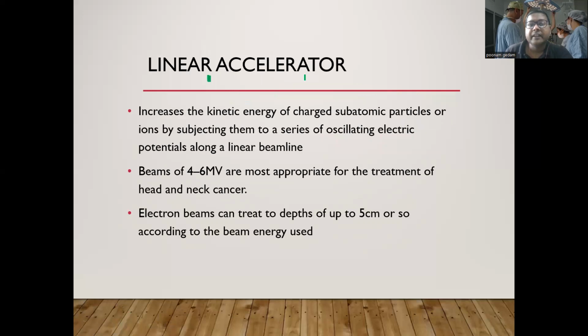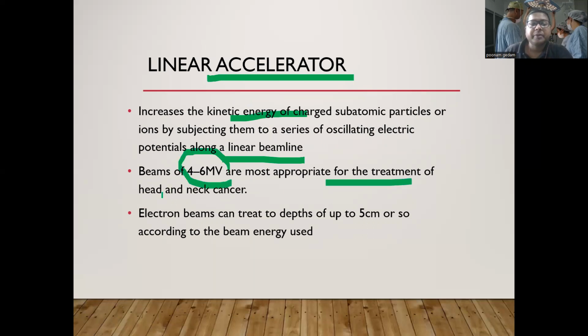So coming to the linear accelerator. It increases the kinetic energy of charged subatomic particles or ions by subjecting them to a series of oscillating electric potentials along a linear beamline. Beams of 4 to 6 megavolt are most appropriate for the treatment of head and neck cancer.